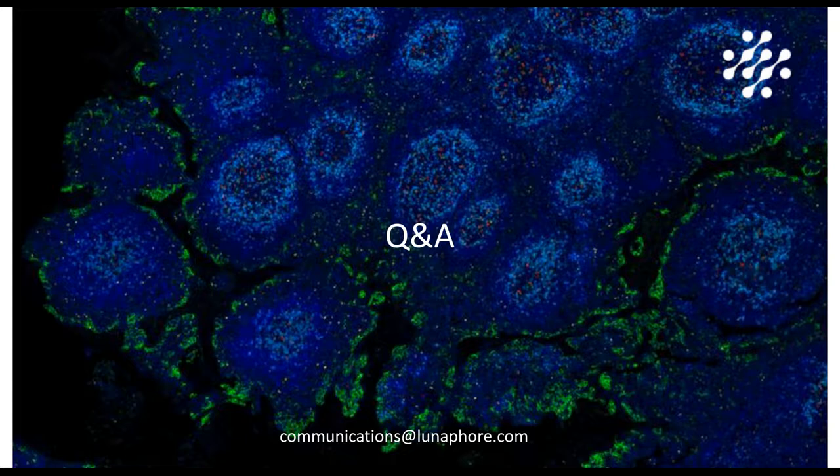So here in this study, we could run a single slide in 4 hours and 30 minutes. So yeah, if you're looking just at turnaround times, I would say it's 3 hours and 30 minutes against 12 hours.